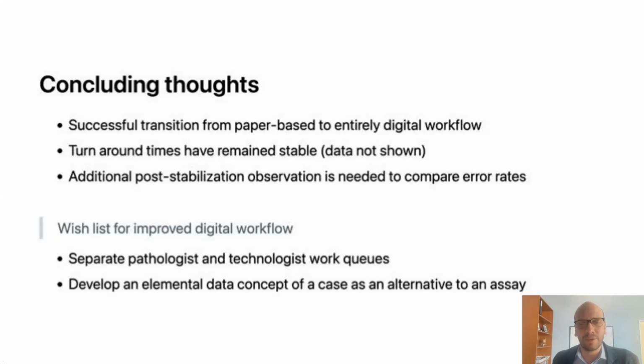It would also be great if there was a concept of a case instead of an assay. What do I mean by that? So take our example from surgical pathology, where a specimen can be accessioned under one accession number and then subjected to all the necessary testing to assign a diagnosis. So in this way, the protein electrophoresis, the immunotyping, free light chains could all fall under one concept that could be interpreted and validated together.